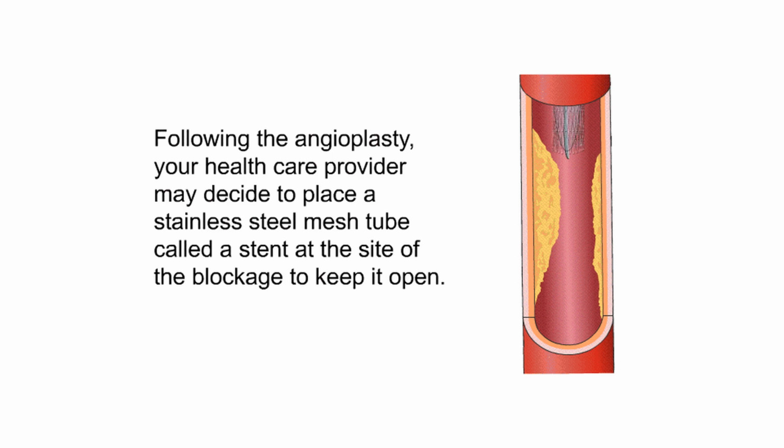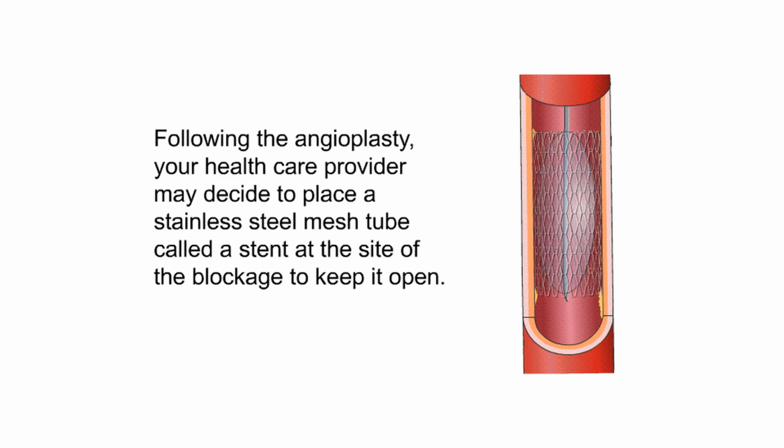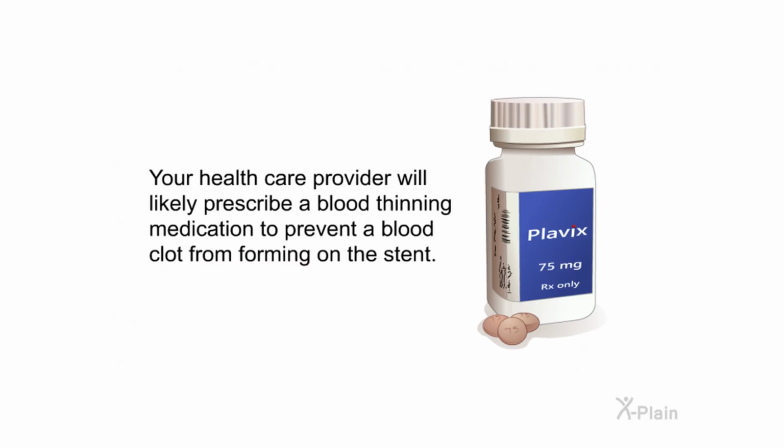Following the angioplasty, your healthcare provider may decide to place a stainless steel mesh tube called a stent at the site of the blockage to keep it open. Your healthcare provider will likely prescribe a blood thinning medication to prevent a blood clot from forming on the stent.